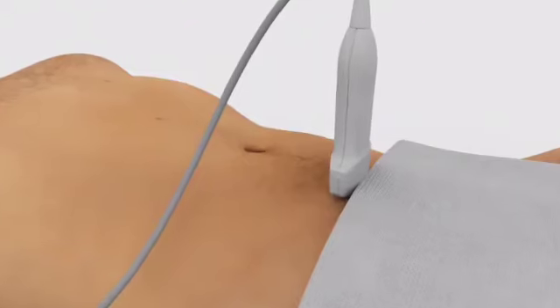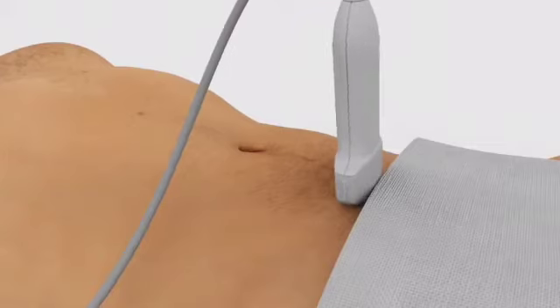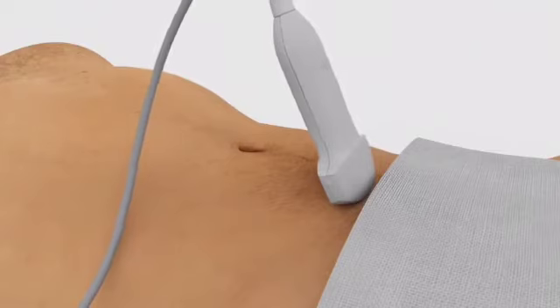To obtain a transverse view of the bladder, position the probe so that the probe marker is pointing toward the patient's right. The urinary bladder is a pelvic organ, so the transducer must be positioned just superior to the pubic symphysis and aimed into the pelvic cavity.